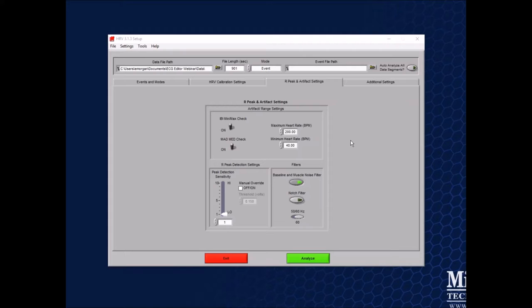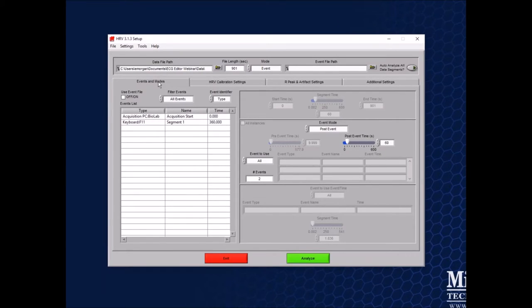You can also reuse edits across different event modes. It's okay to edit in one mode, switch to another, and apply those edits. But make sure you look at the segments of data before writing them to Excel, because edits that made sense in one mode might not make sense in another — they might create a gap in data for HRV that would no longer be valid to calculate RSA.